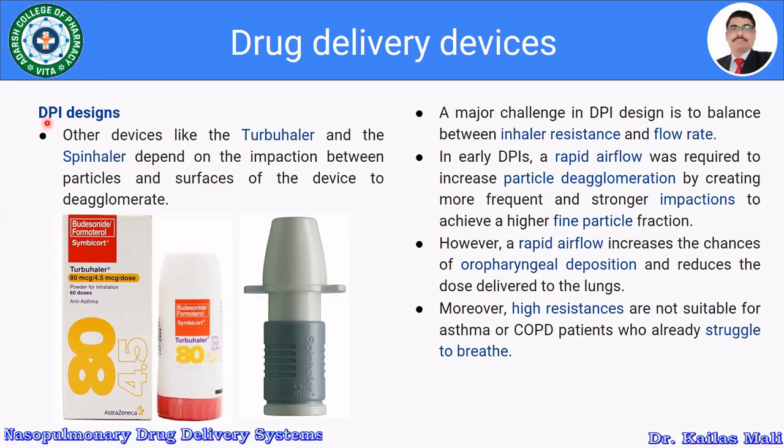Let us see the other designs which are used in the dry powder inhaler. Other devices like the Turbohaler and the Spinhaler depend on the impaction between particles and surfaces of the device to de-agglomerate. So this is the Turbohaler device and this is the Spinhaler.